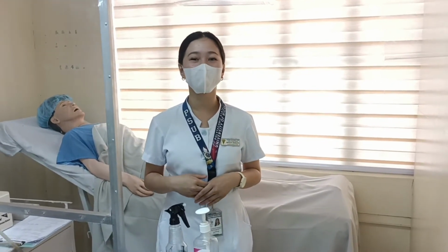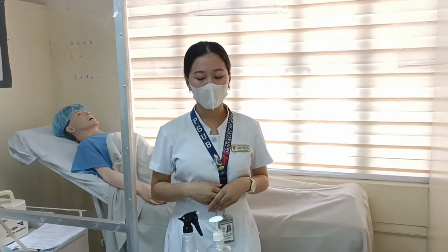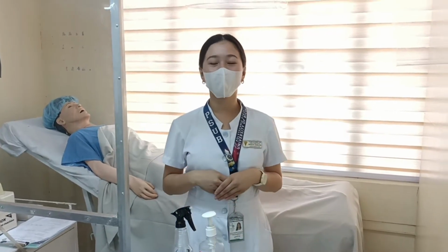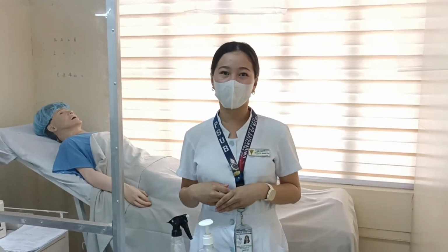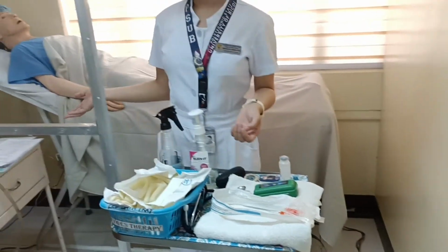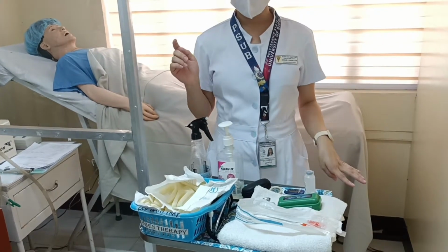So, suctioning is the aspiration of secretion from the catheter. The purpose of this is to remove the secretion, to facilitate ventilation, to obtain secretion for diagnostic procedure, and to prevent the infection.